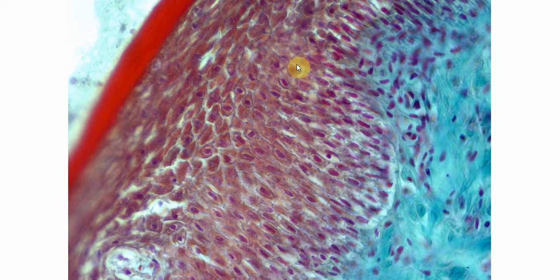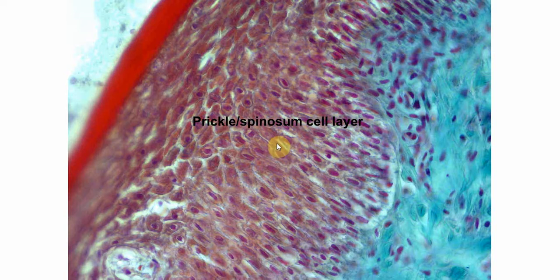This cell layer is the spinous layer and these cells have an ovoid shape. You can see, for example, this cell — these cells are more ovoid in shape.